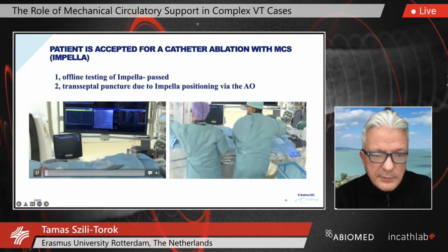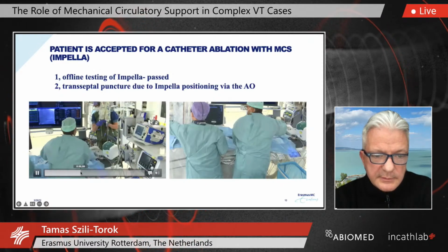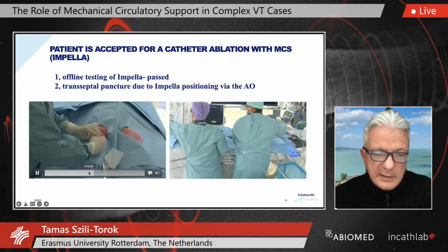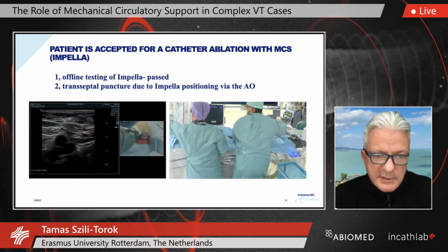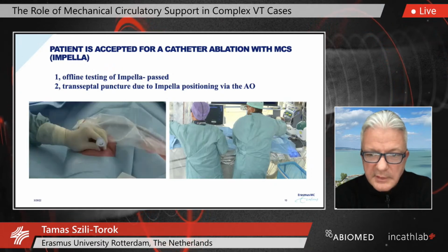Now, the way we do it is similar to you guys. Indeed, we also perform the punctures echo-guided, at least most of us, except me.